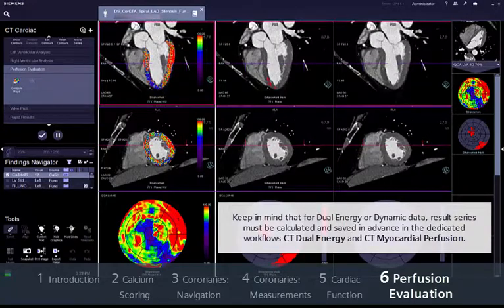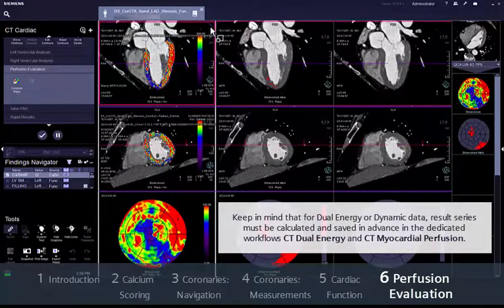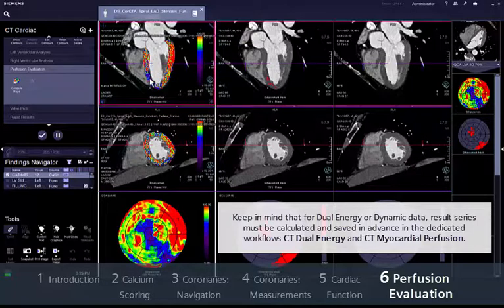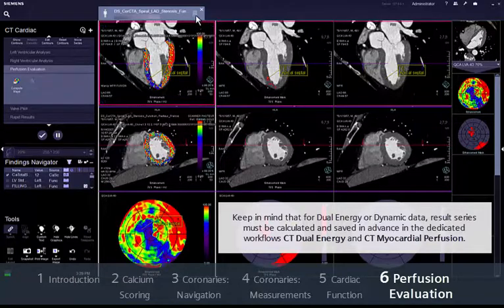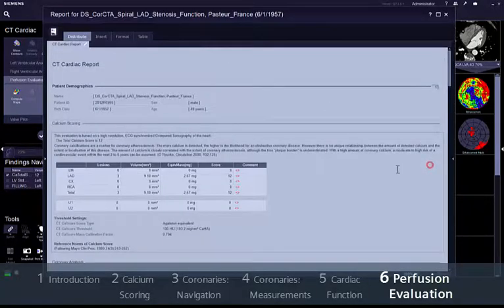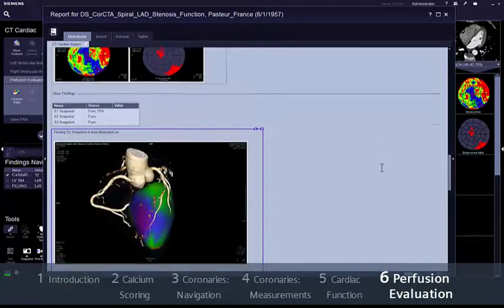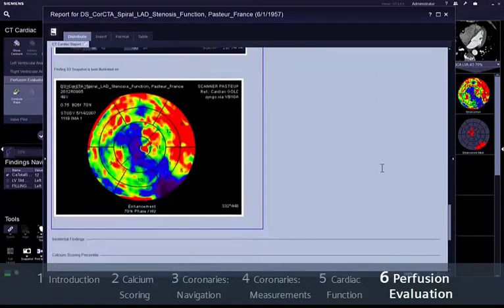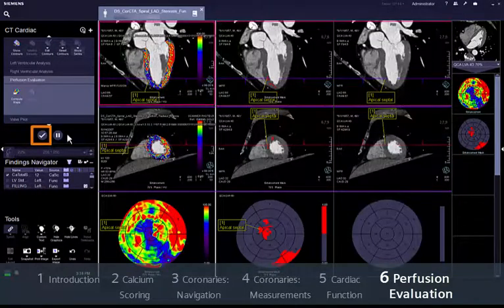Keep in mind that for dual energy or dynamic data, result series must be calculated and saved in advance in the dedicated workflows CT dual energy and CT myocardial perfusion. All results are conveniently collected in a report, and saving and archiving this report and the results series is as easy as completing the workflow by clicking the 'Save and Send' button.